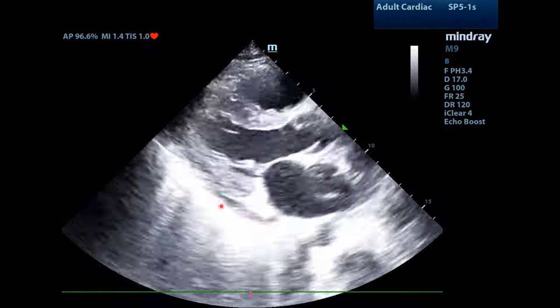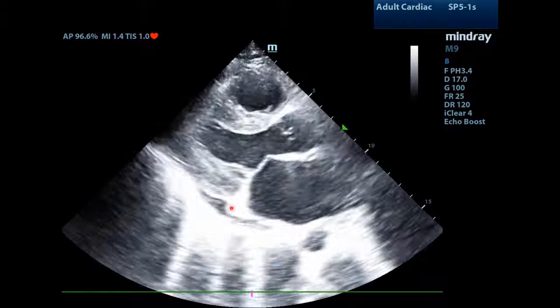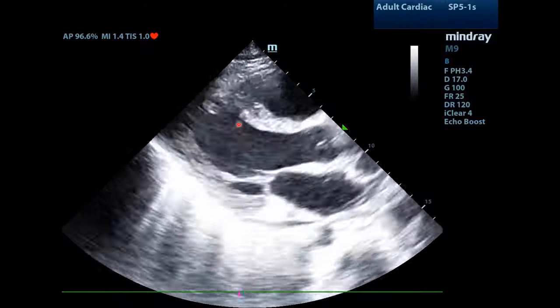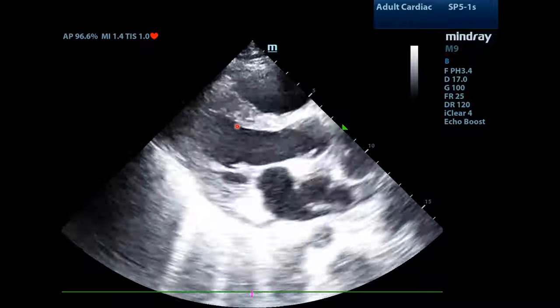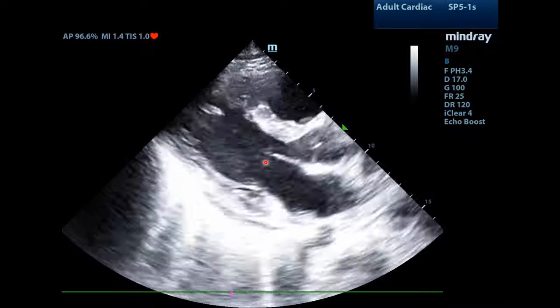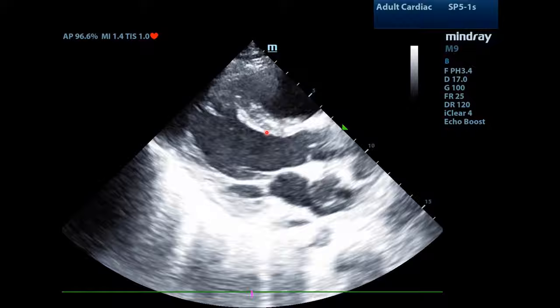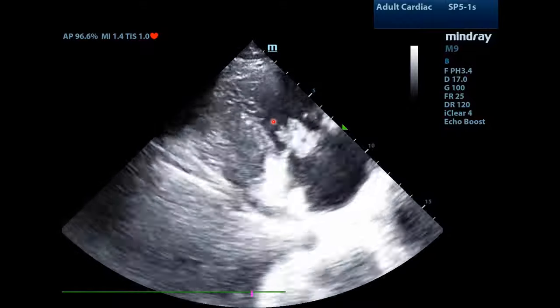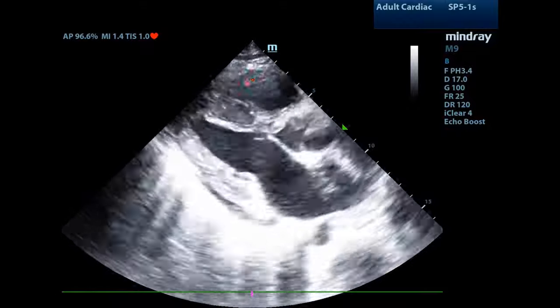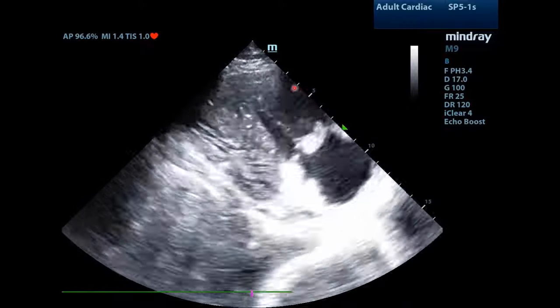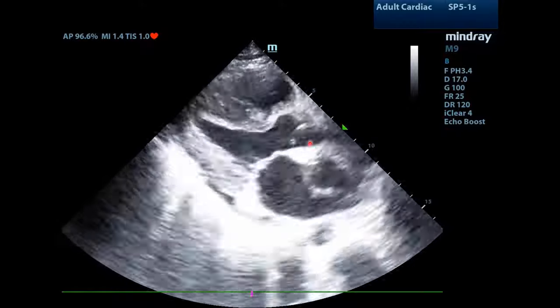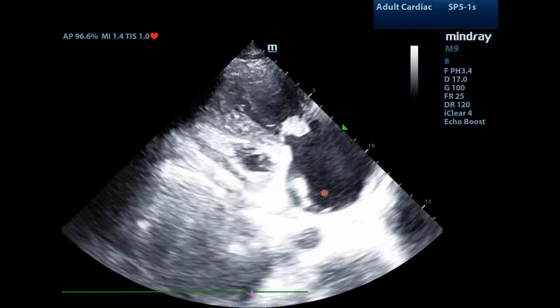There is a trivial pericardial effusion present right here. The left ventricular ejection fraction is normal, as evidenced by the fact that there is good fractional shortening of the left ventricle and that the anterior leaflet of the mitral valve is touching the septum. The RV does not look excessively enlarged based on the rule of thirds, where the RV is approximately the same size as the outflow tract and the LA.